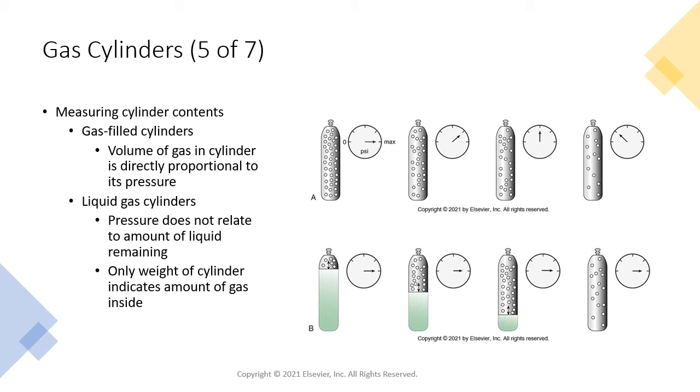What gas law does that sound like? If a cylinder is full at 2200 psig, it will be half full when the pressure decreases to 1100 psig. To know how much gas is contained in a compressed gas cylinder, one only needs to measure its pressure.